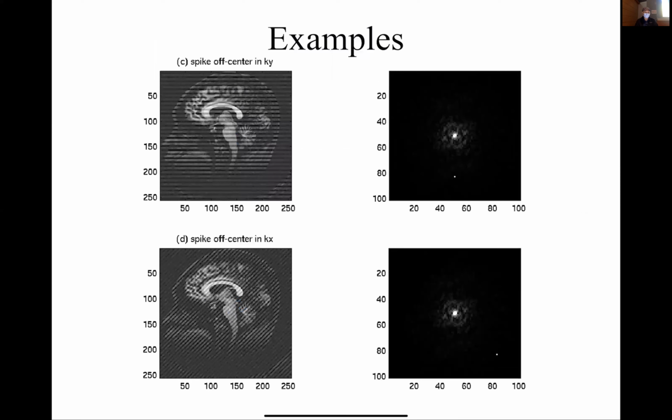And these are what are known as corduroy artifacts, which you see once in a while in MR. So if you ever get an image back that looks like this, then you'll understand what's going on. These happen anytime the energy we're looking at in MR is at RF frequencies. If there's a leak in the shield around the room, some energy can get in.